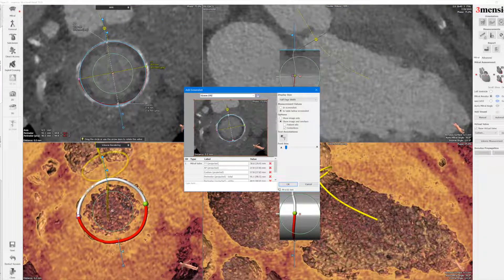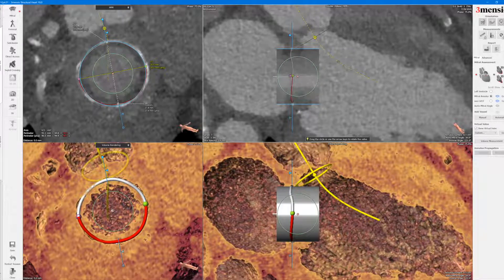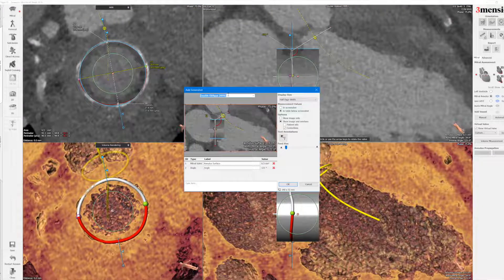This is a 31mm EPIC, so you can label that. You can also do that here and use the angle tool. You draw the angle between the aortic annulus and the prosthetic mitral annulus — this is the aortic-mitral angle — and you can see how that balloon-expandable valve fits. You can label that as well.